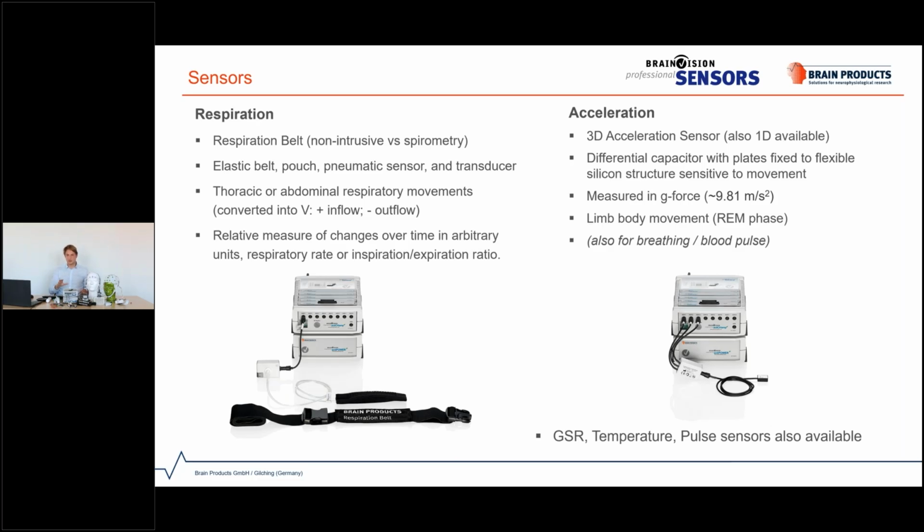Together with these sensors that are particularly relevant for sleep applications, we also have a GSR sensor, a temperature sensor, a pulse sensor, and if you think about including these into your paradigm, you can simply drop us an email or contact your local distributors, and he or she can give you more, or we can give you more information on it.